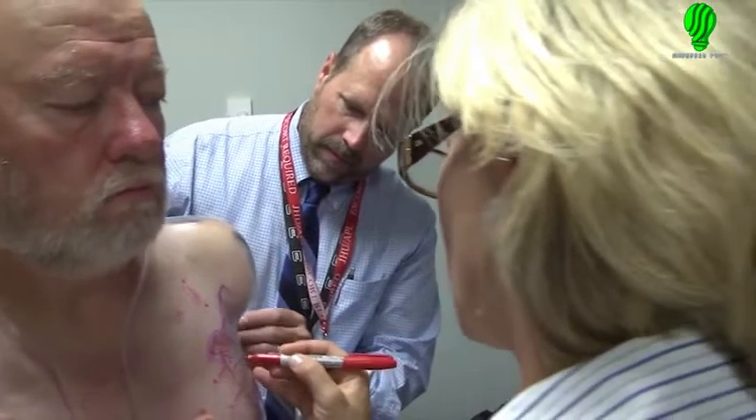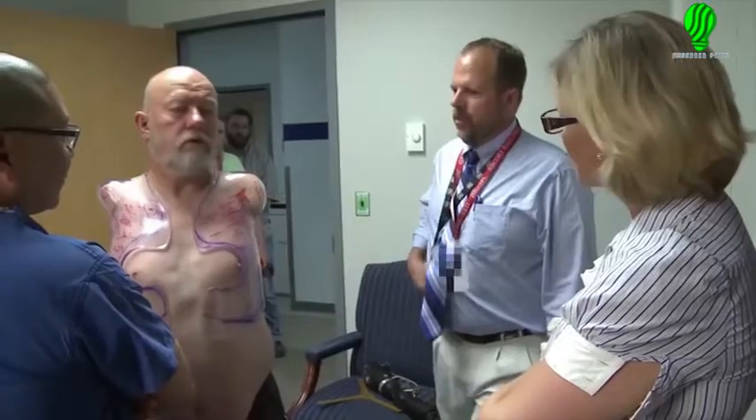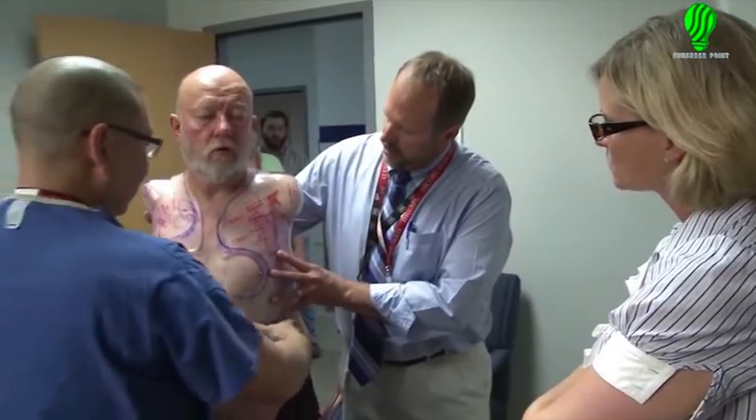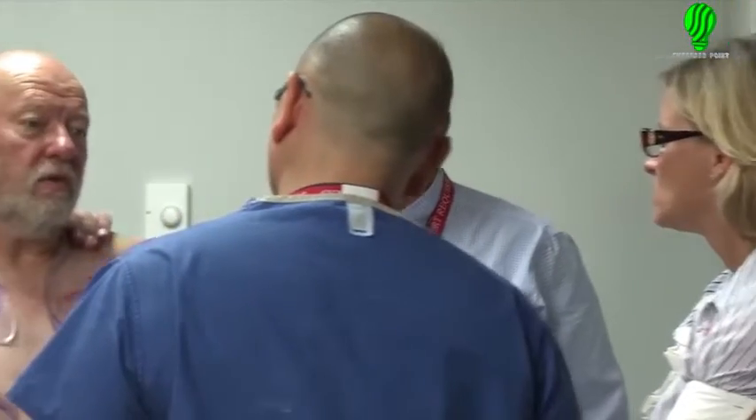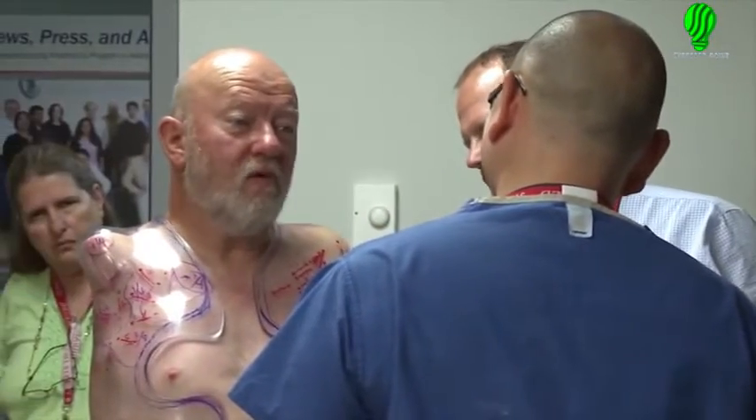The first cast they did on me for the test socket was all done with electronics. They took like a scanner and they just started walking around my body, and they just painted it on the screen, and they sent it off, and I get out here and it fits. But this guy says no, I can't feel every little dimple and divot that I want to feel. He says, I want to do it with plaster. And this old school is working out so much better than the modern.